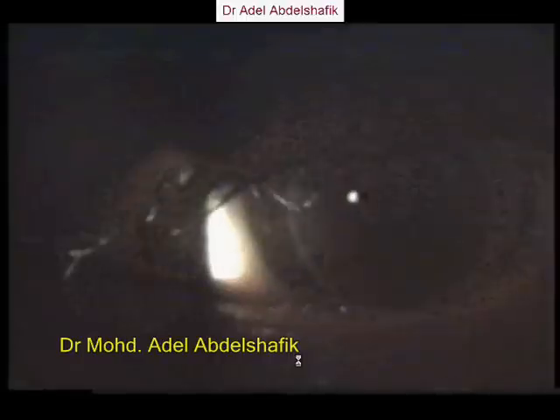And in this video, you can see there is some ring here inside the cornea, right? This is the case of keratoplasty.